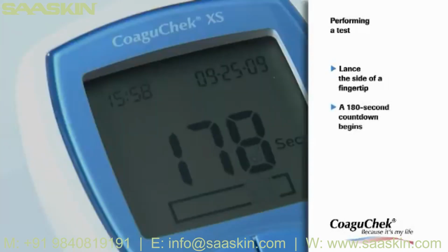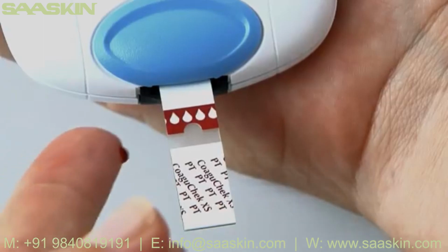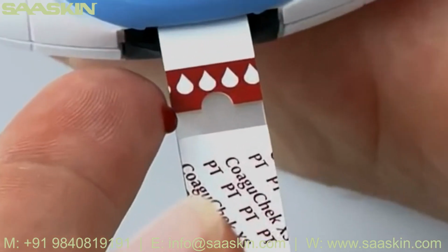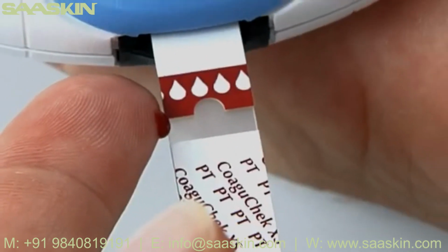Gently massage the finger while keeping an eye on the 180-second countdown. It is very important to apply the drop of blood within 15 seconds of lancing. Apply the blood drop to the side of the sample application area. You can also apply the blood drop to the top of the strip.